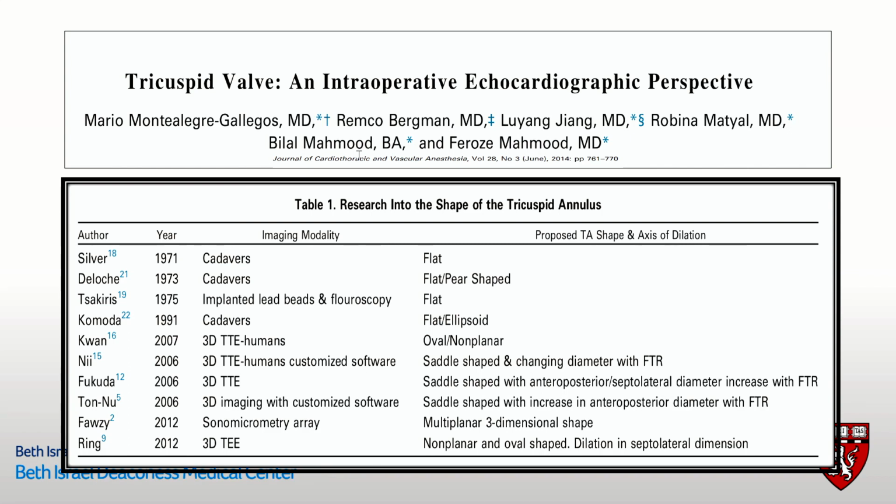The next question to answer is, is it a real, true, perfect circle? This is from one of our papers where we went over the different studies which related to the assessment of the tricuspid annulus.